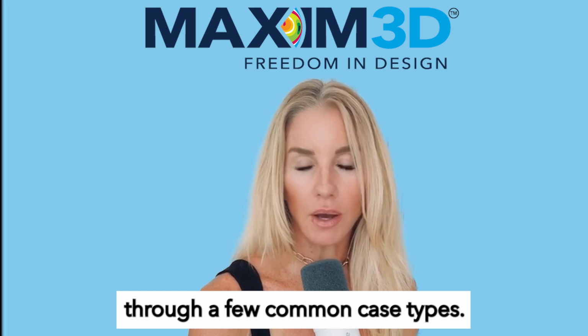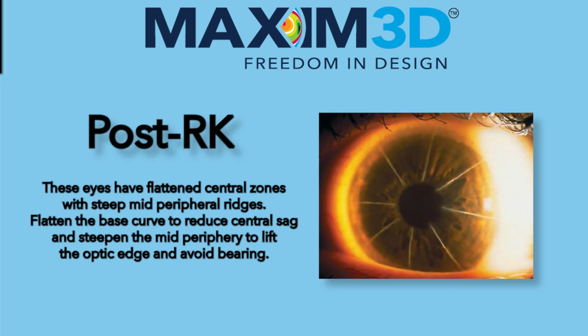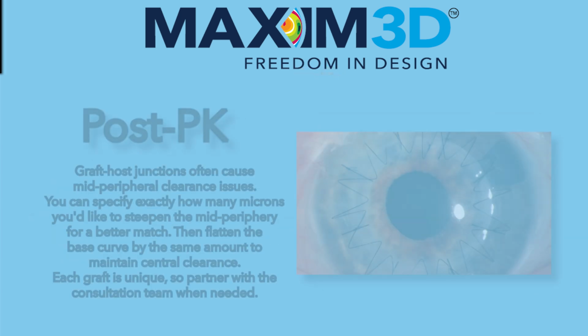Let's run through a few common case types. Post-RK, these eyes have flattened central zones with steep mid-peripheral ridges. Flatten the base curve to reduce central sag and steepen the mid-periphery to lift the optic edge and avoid bearing.